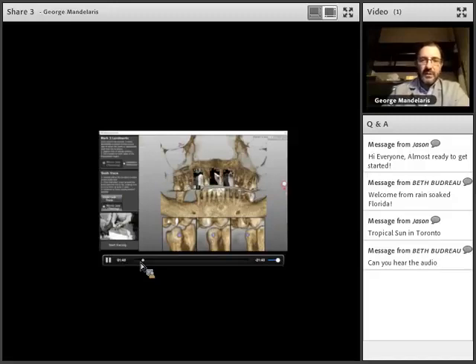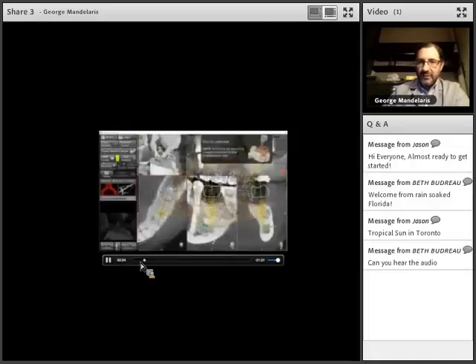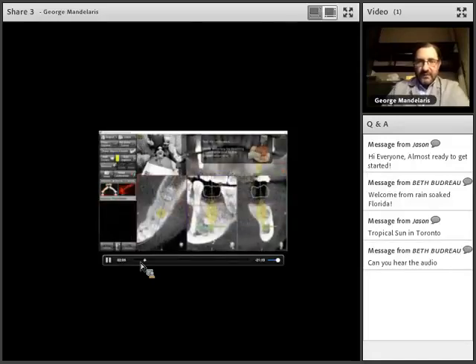Again, today we try to do 4 landmarks rather than 3. The wonderful thing about these guys is that they're always making innovation. They're always changing. So if there's a better way to do it next week, we might be mapping 5 teeth if it's going to make a difference. So there's always innovation going on with Daron and everybody in Toronto. So that's awesome.